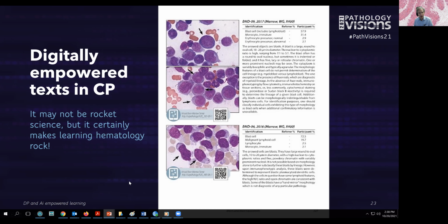And this is something that really can be very important. In fact, in a study that we did a few years ago, it was demonstrated that residents retained and were able to apply more readily the criteria that they had observed from published articles if they had been able to also examine the digital slide, interact with it, and see the broader context in which that finding or those circumstances were presenting. So giving people the context beyond just a small window into a few clustered cells is very valuable.